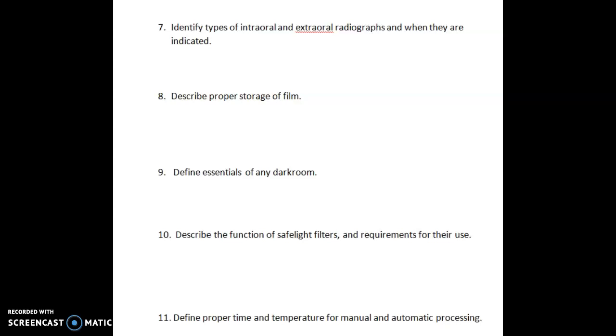You're also looking for any periapical lesions, abscesses, granulomas, things like that that could be occurring around the root of the tooth, not visible clinically. Often when patients come in, if they're having a toothache or a symptomatic tooth, you'll just take an individual periapical of that tooth, or the dentist may want you to take a periapical of that tooth along with a bite wing of that area. And so that would give them a good indication of the health overall of that tooth.